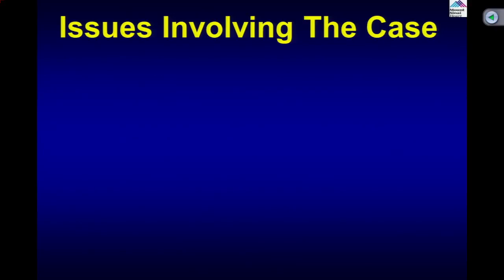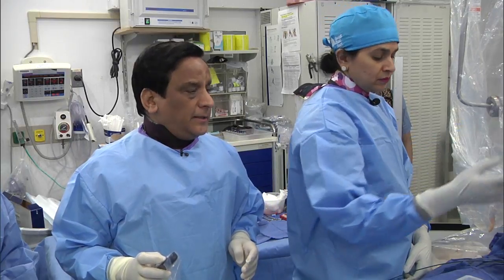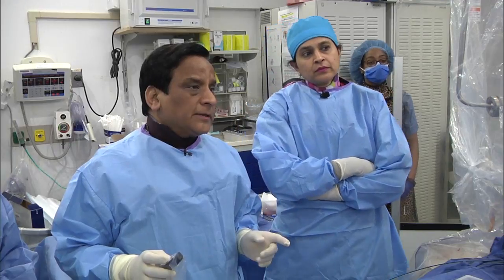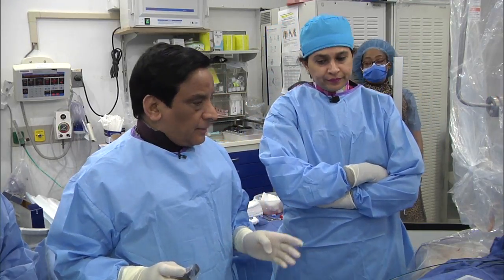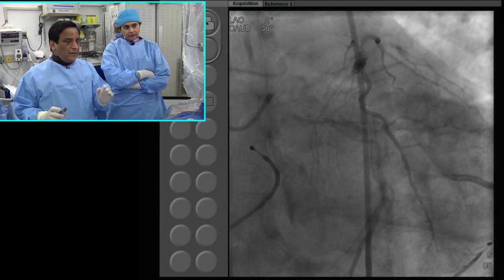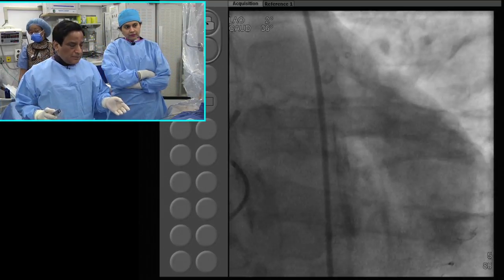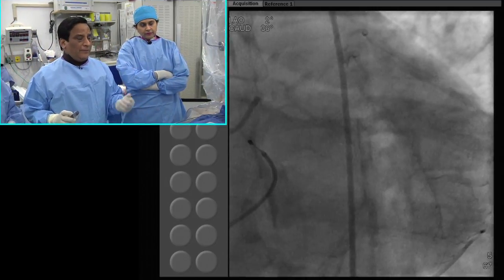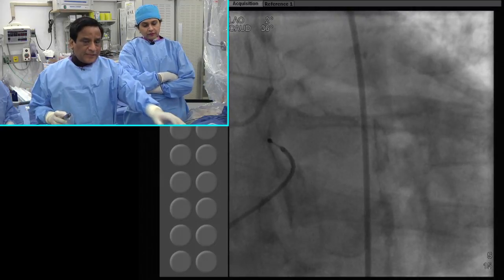Yes, the real question I bet most of the viewers are going to be thinking is what about the use of either Impella or a balloon pump here? That's another very good point. In this particular case, despite a normal ejection fraction, because of the complexity... usually with a normal EF we try to not put in any of these assist devices, even by our algorithm, because clearly all those assist devices, Impella or balloon pump, will have a higher complication rate, but everything is inside the room.